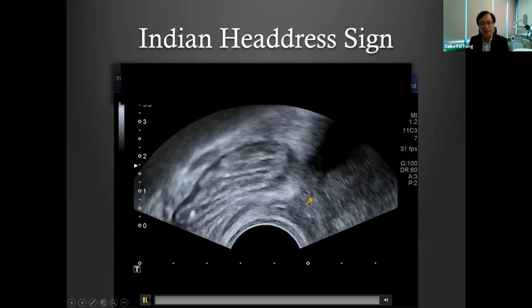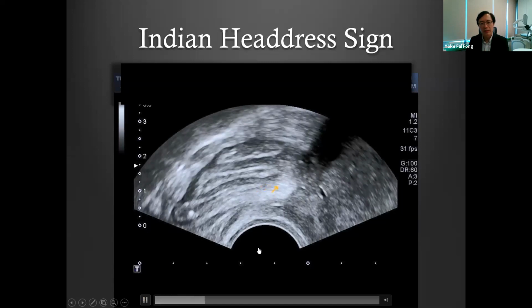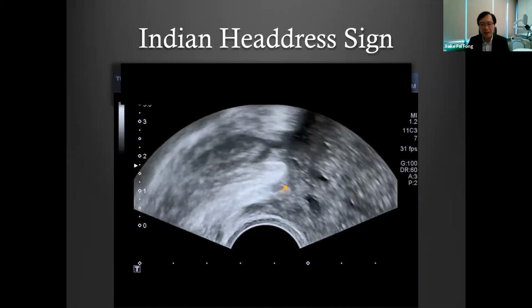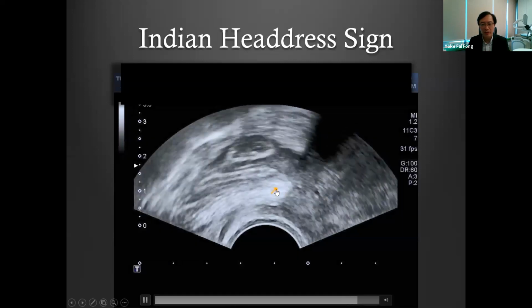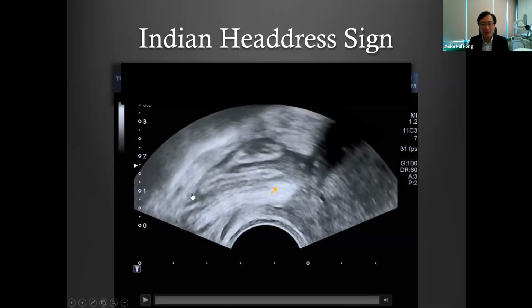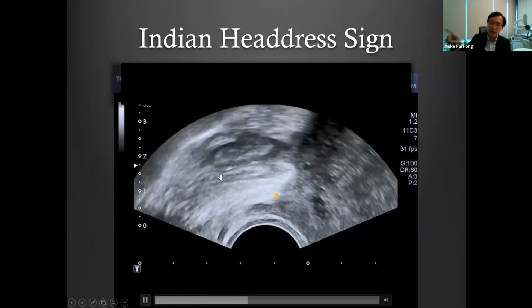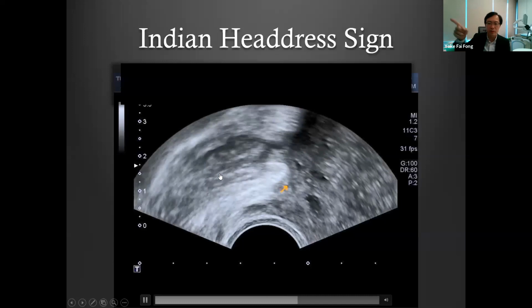Okay, now this is the video. So first thing is you can see that it is stuck. It just doesn't move. The rectum is stuck onto the uterosacral ligament over here, right? Yeah, and you can see the folds of the rectum. It just goes like a snake like that. It just goes this way. Okay.